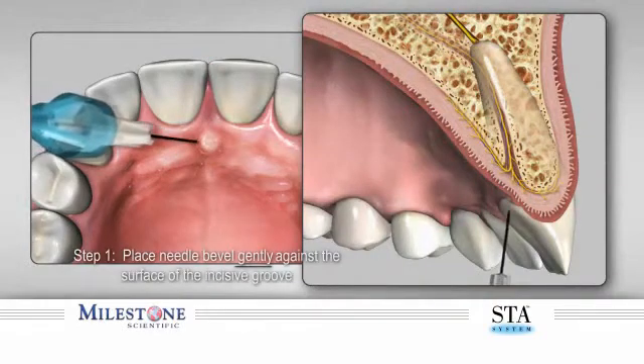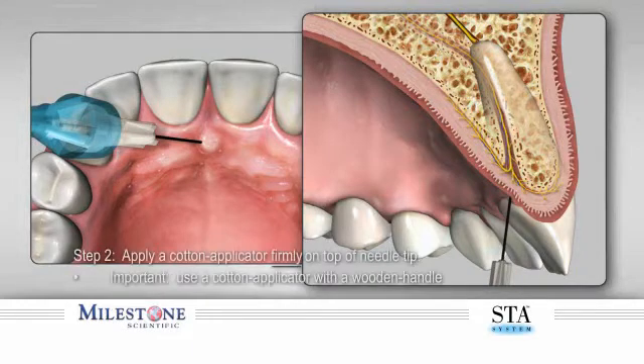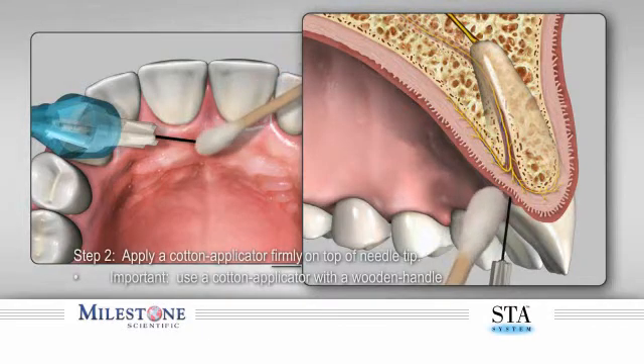Step 1: Start the PASA injection by using the pre-puncture technique. Gently place the bevel of the needle against the surface of the incisive groove. Step 2: Stabilize the needle by applying pressure from a cotton applicator. It is best to use a wooden handle cotton applicator so that adequate pressure can be applied. The applicator absorbs any excess anesthetic solution and makes for a more comfortable needle entry.